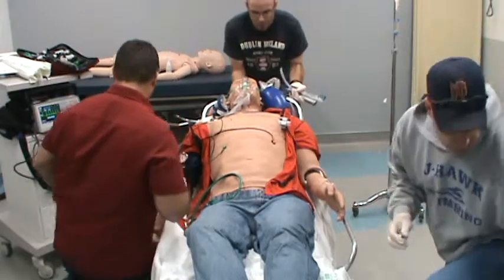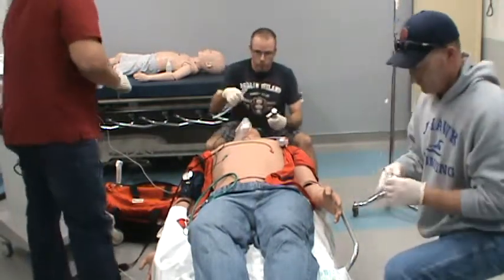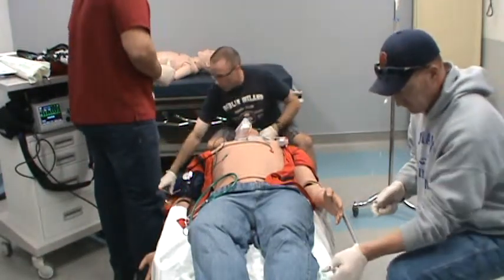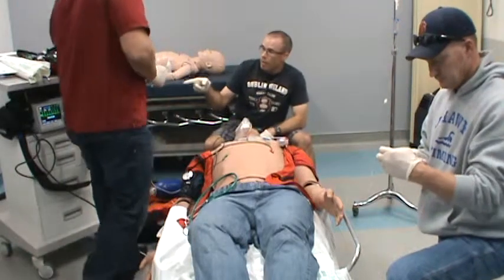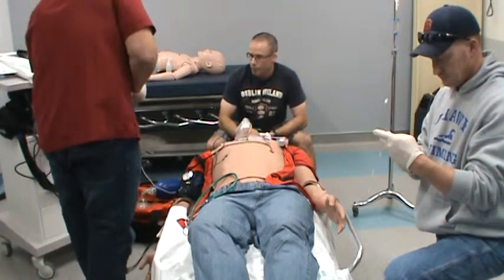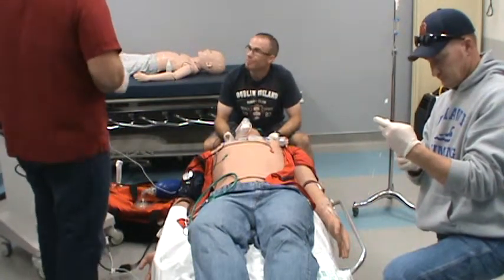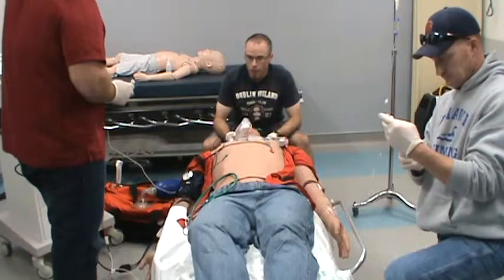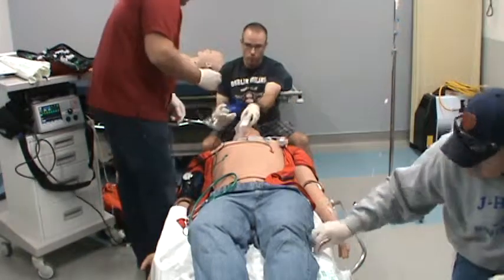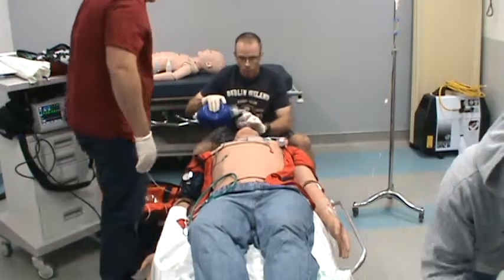Sir, we're going to lay you down flat. And so we got a blood pressure, we got a heart rate, we have them on the monitor, okay? And let's put it in waveform so we can start warming up the end-tidal CO2. What is our pulse ox right now? It's 88. 88%, okay. I tell you what, let's go ahead and switch over to bagging. Why don't you get a nasal airway for me? Nasal's in. Okay.